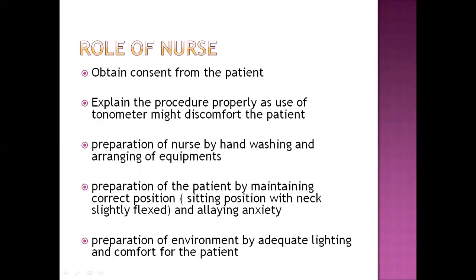Role of nurse is somehow same in every procedure. First of all, obtaining consent and then explaining the procedure, explaining every activity that is done in the procedure, as well as explaining the benefits of the procedure. The nurse should also explain that tonometer might firstly discomfort the patient slightly, but as the procedure advances, there will be no discomfort. Nurse should prepare herself by hand washing and arranging the equipments.